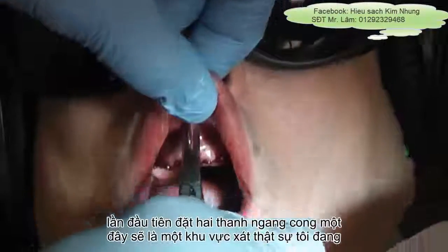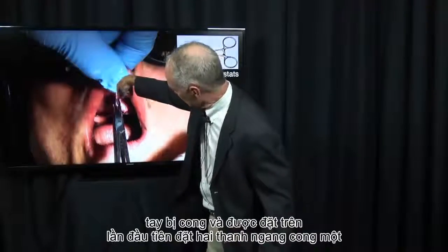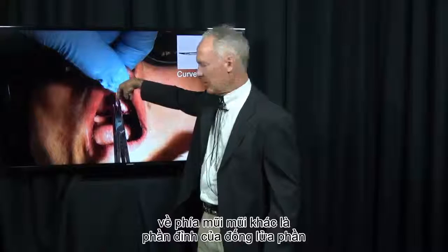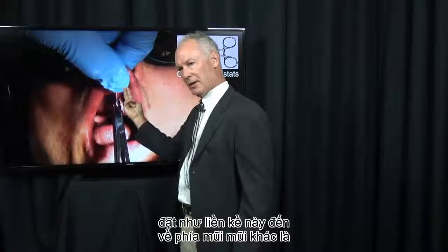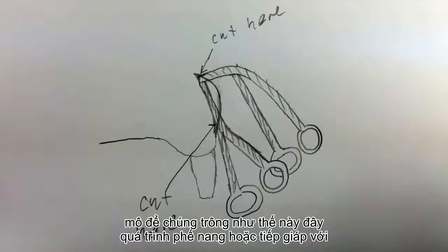I'm first placing two curved hemostats. One hemostat is curved and is placed on the apical part of the frenum — the part toward the nose. The other hemostat is placed adjacent to the alveolar process or adjacent to the tissue, so they look like this.